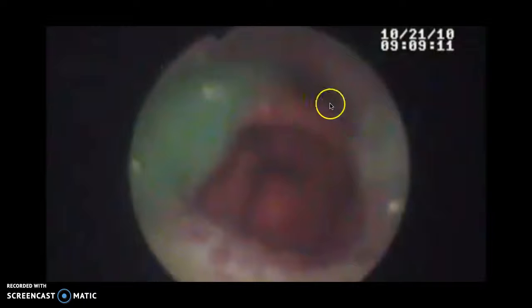Now here you can see it's a lot clearer. There's not much left over, but on this side it's pooled up, and that makes us believe there's a lot of residue there, pooling up because the muscles aren't strong enough to force or redirect the liquid or the material back into this area over here. Now, I know you're not having this issue with solid foods, so when I'm talking about this, I'm referring strictly to liquids. What we want is to see this liquid go back into this area and be forced down into the proper area, which is the esophagus, which goes into the stomach.